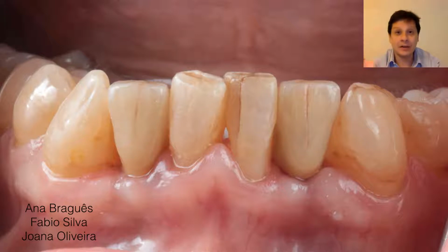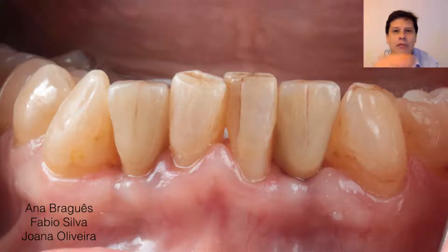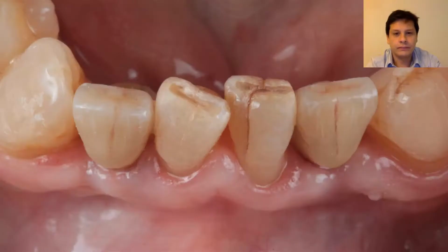So we're better at surgery because you're faster and accurate, and we're better at prosthodontics because you're also better and accurate. You don't have the mistakes of silicones, you don't have the mistakes of casts. So everything is CAD/CAM from the first to the last day, and that is huge.